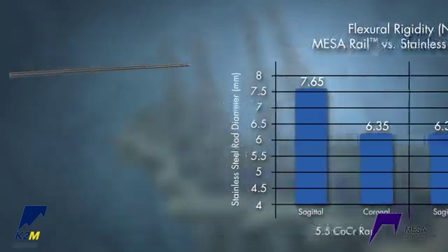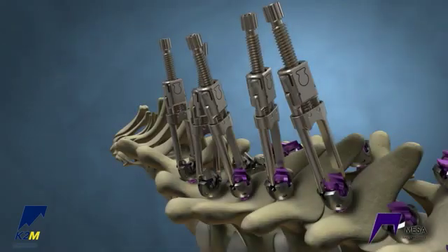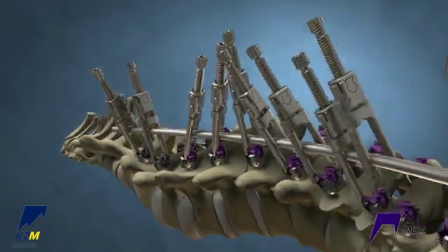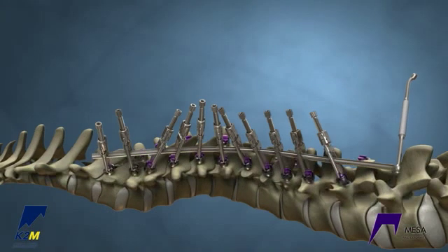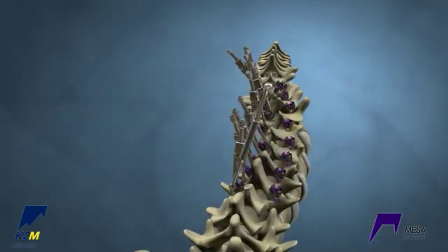Pre-bend the rail into the sagittal plane. Insert the rail through the rail crickets, and secure the remaining crickets on the concave side. Place the rail rotation wrench at the bottom end of the rail to rotate the rail into the proper sagittal alignment.